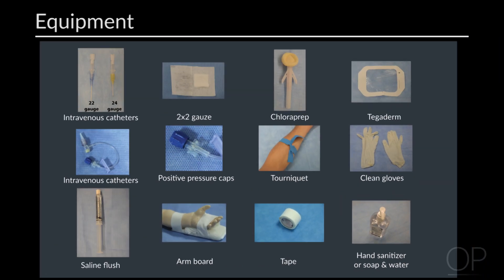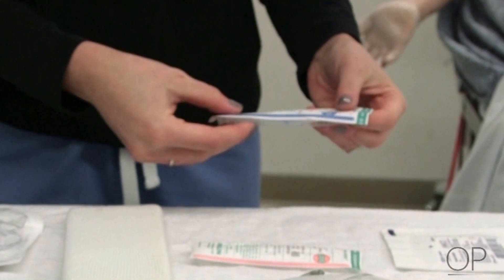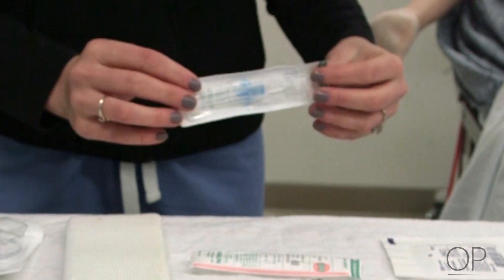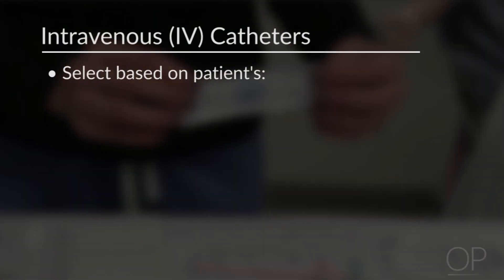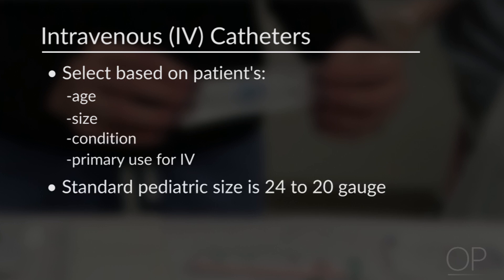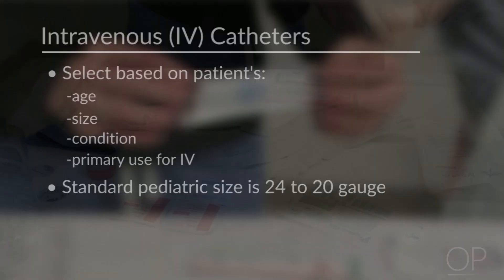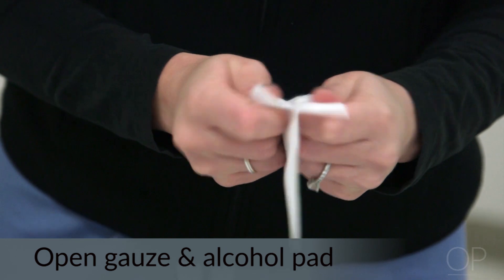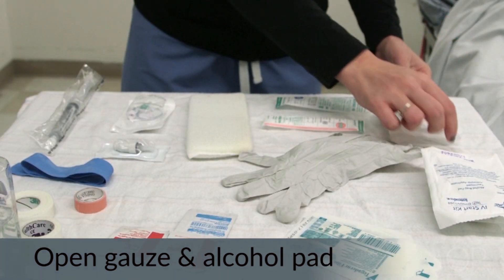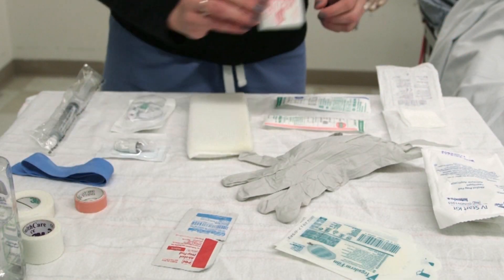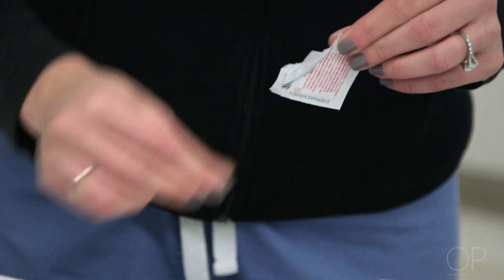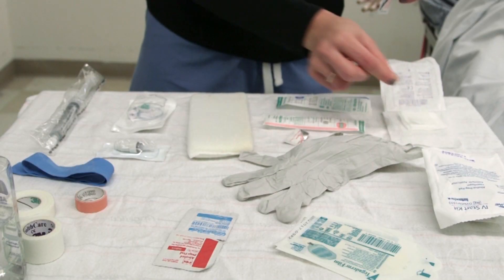Now we're ready for the procedure. You will have the most success if you prepare adequately prior to beginning. First, choose the most appropriate sized IV catheter for your patient, based on age, size, condition, and the primary use for the IV. Standard pediatric sizes are usually 24 to 20 gauge. Next, open the gauze and your alcohol or chlorhexidine cleaning solution. If it is a pre-soaked pad, grasp it at the corner and place it in the center of the 2x2 gauze.